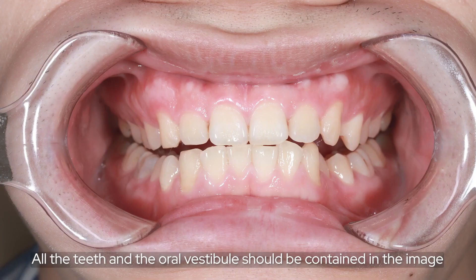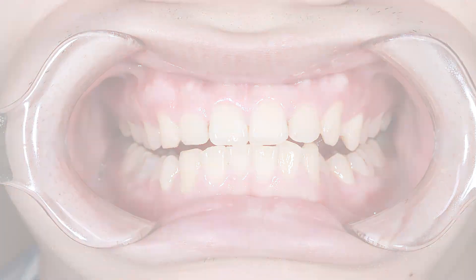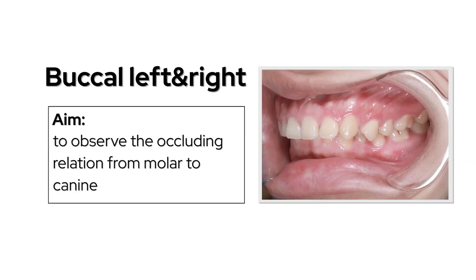All the teeth and the oral vestibule should be contained in the image. Use the buccal left and right views to observe the occluding relation from molar to canine.